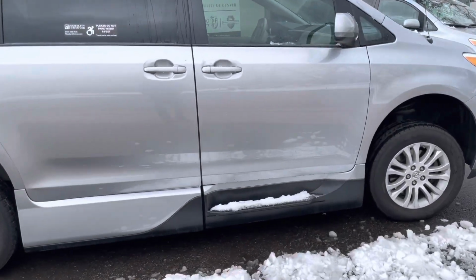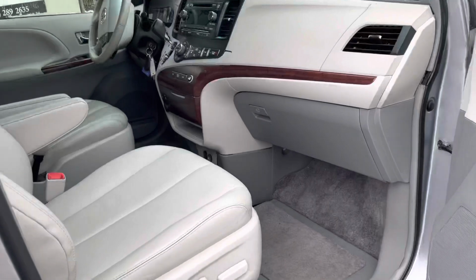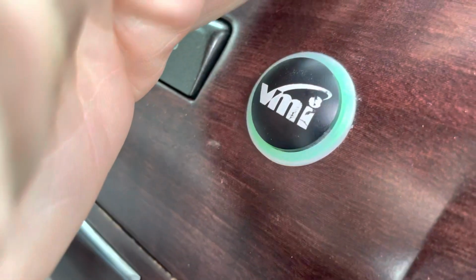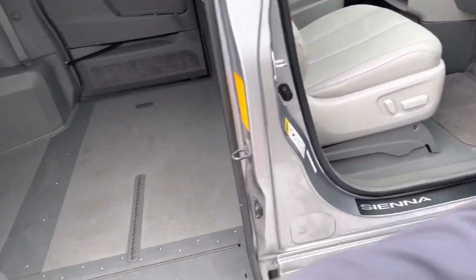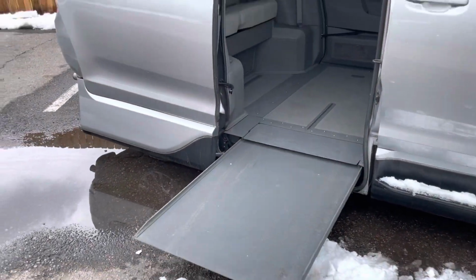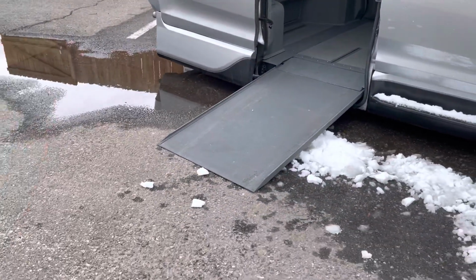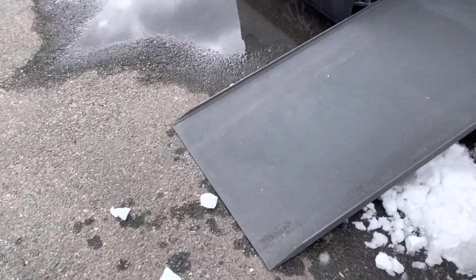Okay, so how this works is you can either press the button on the key, or there's a button right here on the dash. It's the VMI button. You just press that. When it flashes green like that, that means everything is good and the vehicle is opening. So the door will open up and then the ramp comes out, and then it actually kneels down as well. That kneel is what allows the ramp to be at a nice low incline here, so a manual chair has an easier time getting up.